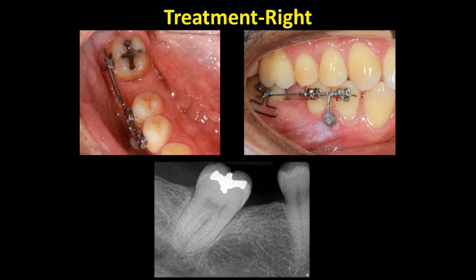And we see the space here, 5.9 millimeters. And the corticotomy cut in this case is going to be on the distal. And you can see here that we're going to come about halfway down the root. Now this is an area where research needs to be done, for we don't know how far apically that needs to go.